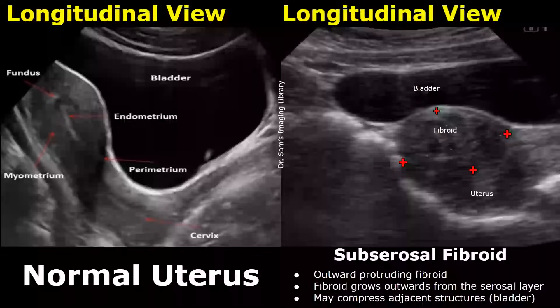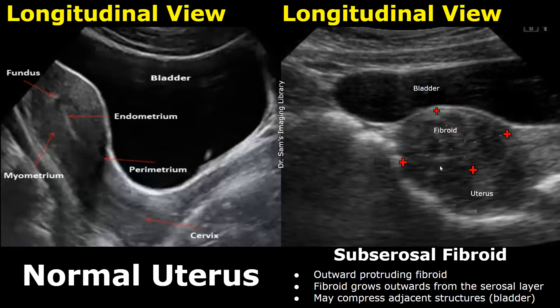This is a transabdominal image of the uterus showing a subserosal fibroid. We can see the fibroid protruding outwards and it has compressed the bladder wall. Due to this protrusion we can call it a subserosal fibroid.